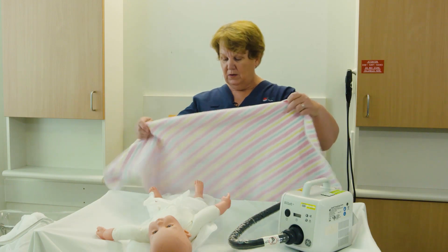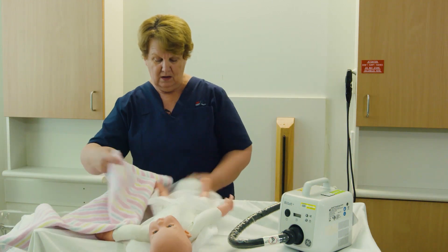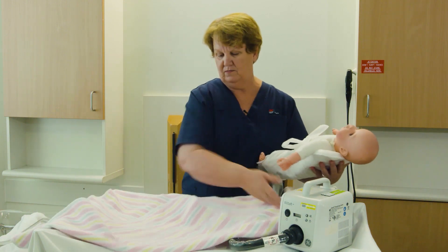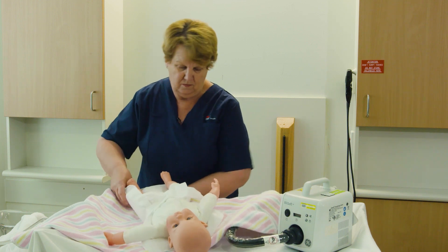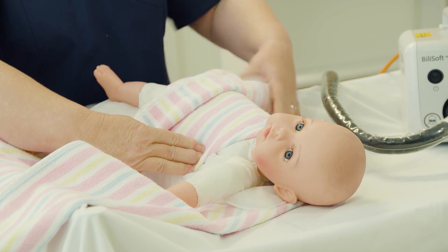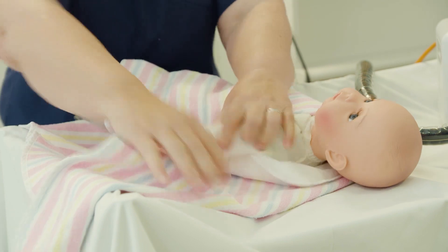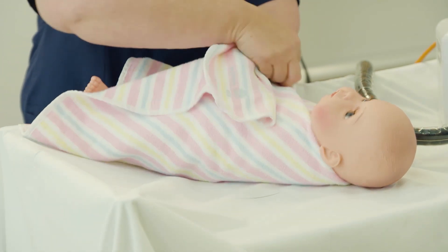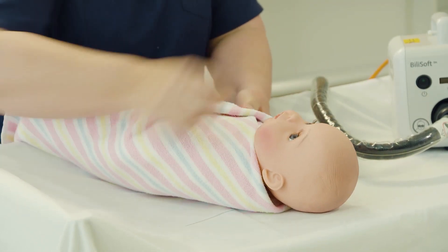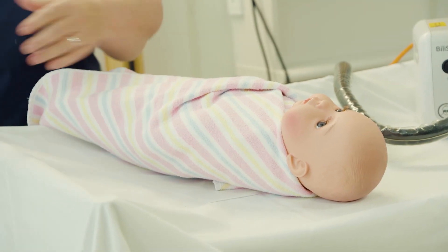As your baby is naked, we need to keep it warm. So we wrap up very firmly with a blanket — this also protects the baby from the light. If your baby is wrapped firmly, that will be enough protection for the infant.